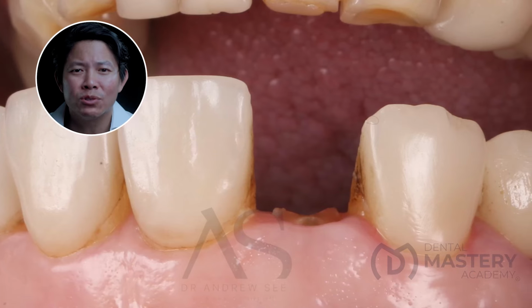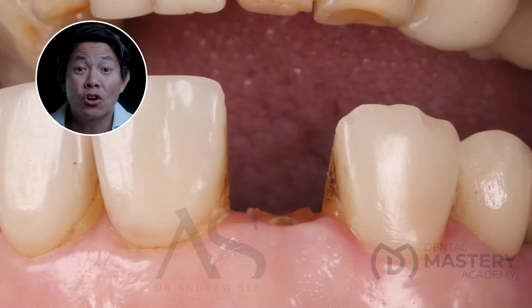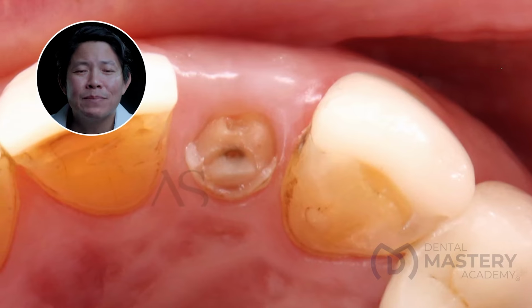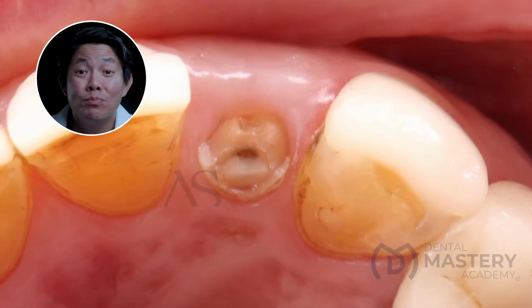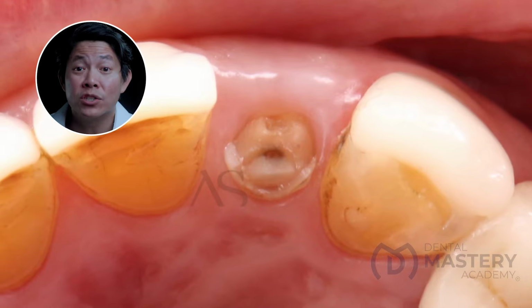In this video, you'll see a case where I used the socket shield technique to replace the upper right lateral incisor. The patient had a compromised 1-2. It had previously been crowned many years ago and the tooth broke off right at the gingival level. Here, we have a very critical decision to make: extract or salvage.